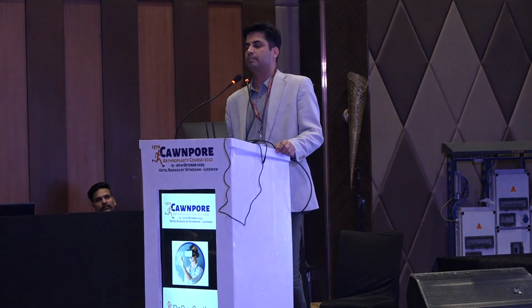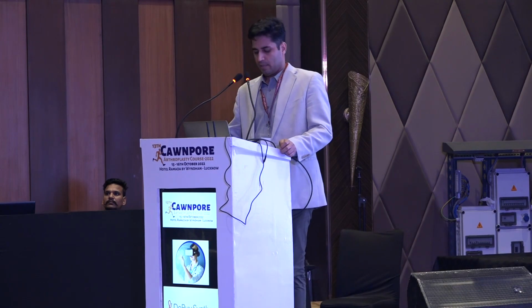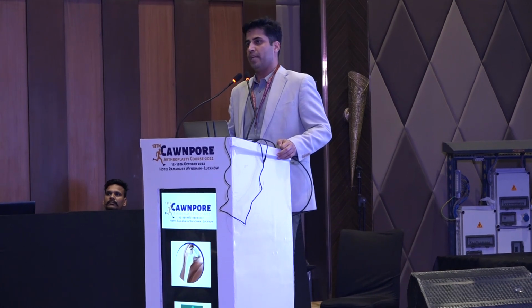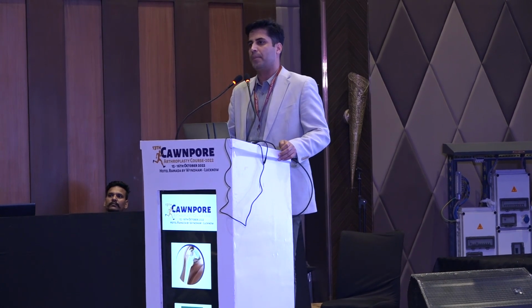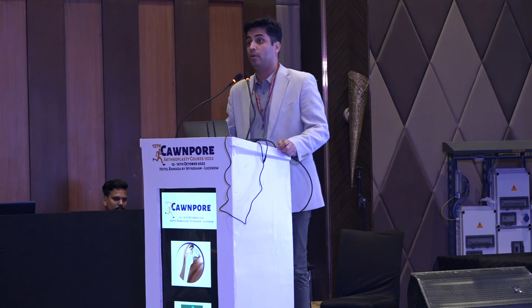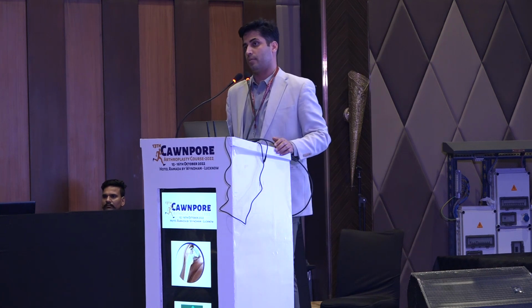Your opinion about the dual mobility cups, how do you weigh it versus the other one? Versus which one, sir? Normal, standard. The standard bipolar. Yeah, so I'm a fan really of going conventional wherever possible. Only where I'm hard pressed, I would put in a dual mobility cup. I'd only put it, for example, where I didn't have too strong an abductor muscle at the end of my procedure, and I was worried about dislocation. Now, the problem is you will get dislocation even in bipolars in this kind of scenario, so you have to be prepared for it.